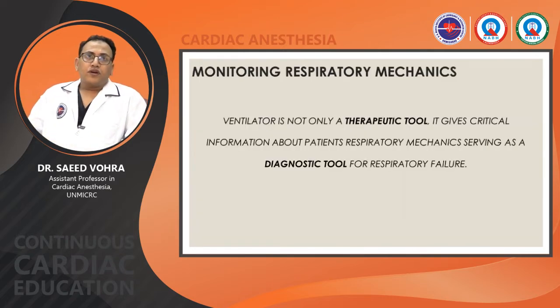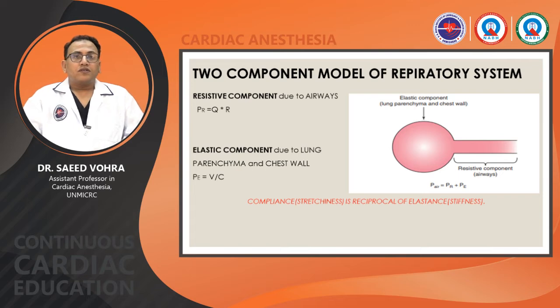Now, coming to monitoring the respiratory mechanics, a ventilator is not only a therapeutic tool, but it can give a lot of information about the patient's respiratory system and can serve as a diagnostic tool for the respiratory failure of the patient.